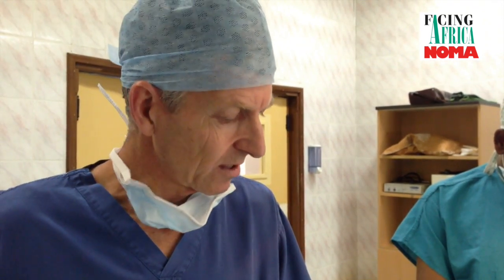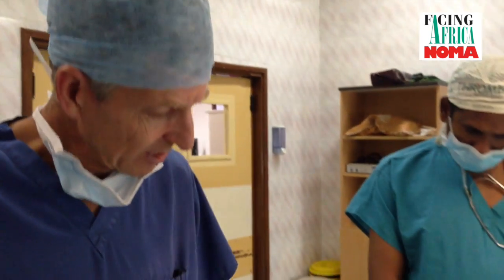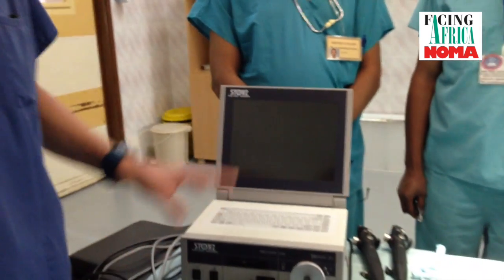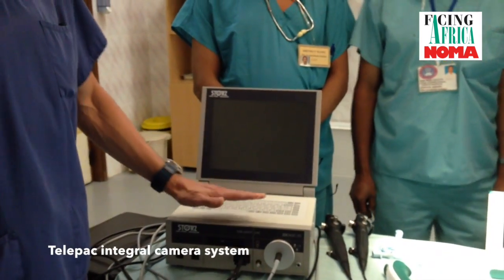Facing Africa airway equipment for the management of NOMA cases. And I'm just going to show you an array of equipment we have. This first clip will involve the fiberoptic intubation equipment that we use. We've had extremely generous donations from Karl Storz Endoscopy Germany, who've donated us a Telepack.